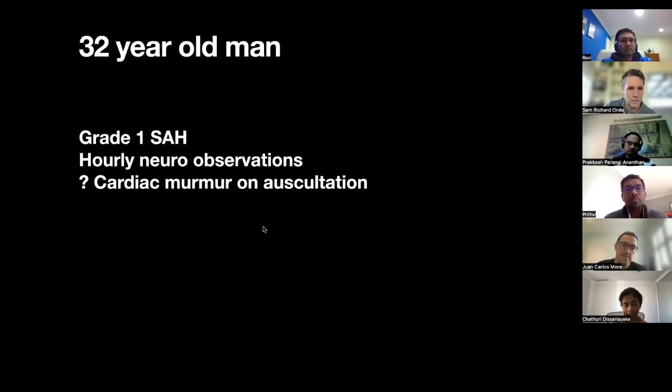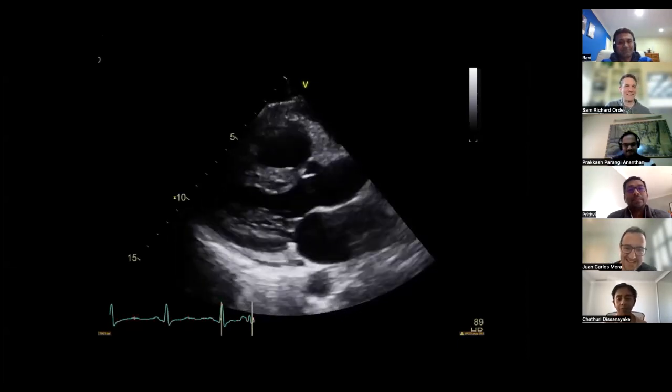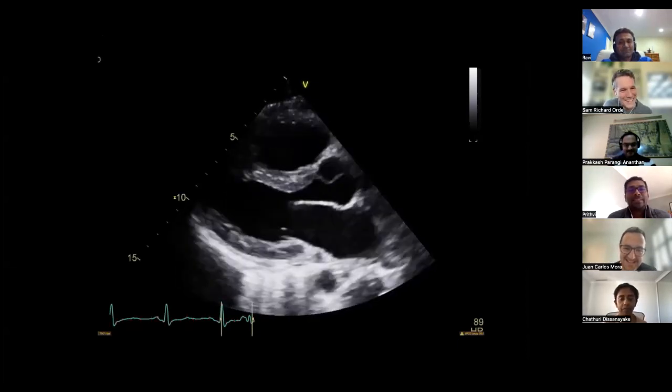Juan, are you happy to do next? Yes. So this is a case that I was reporting earlier this week, and I thought it might be worth bringing up. So again, a little bit curly. Tell me when you're ready to go forward. Didn't realize auscultation was part of neurobs. It's just a holistic approach that we give in Nepean Hospital. Very good. I think it was the junior doctor that did it and put in the request. It wasn't actually me.